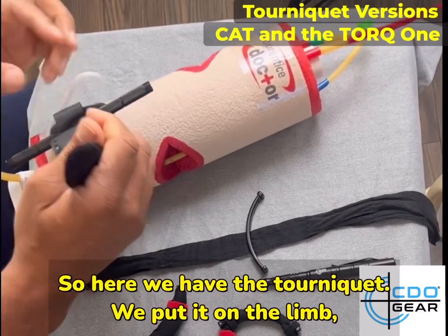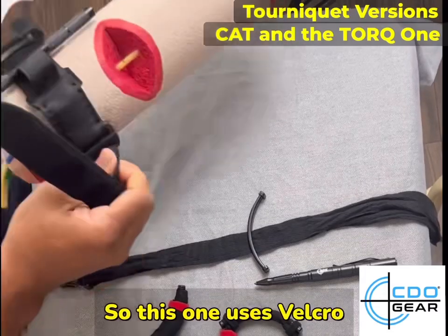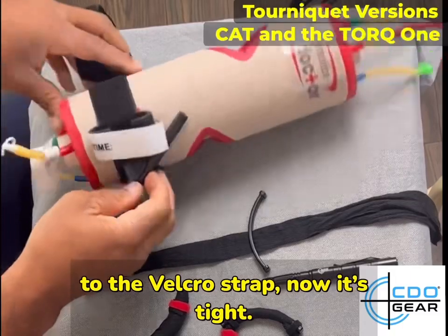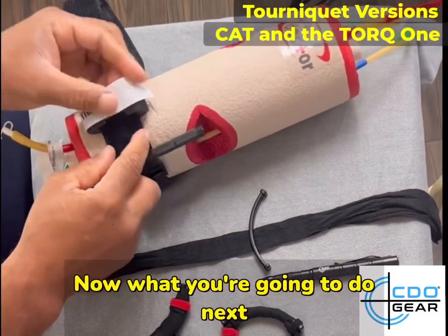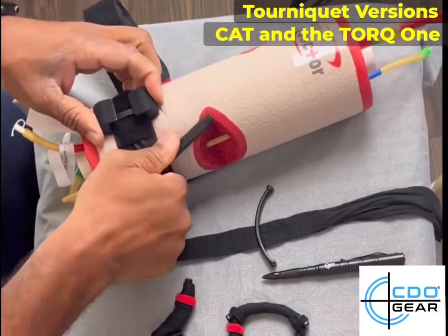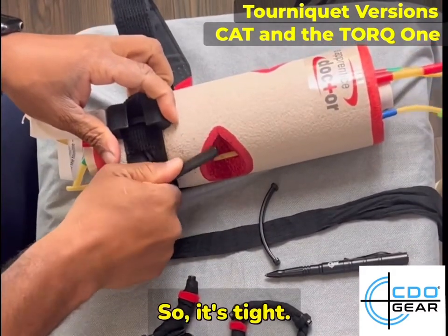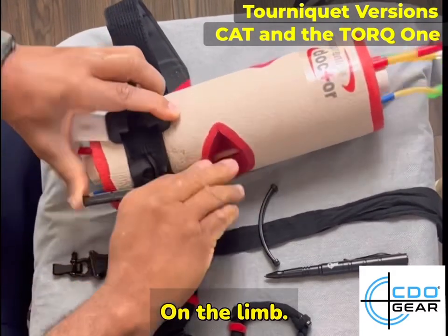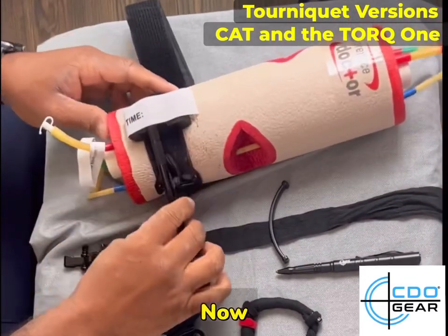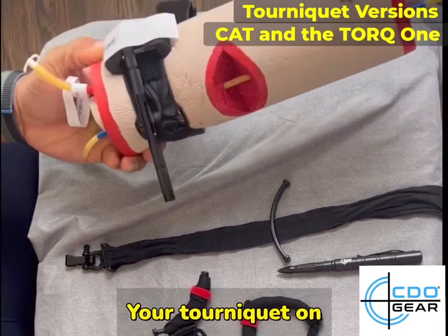So here we have the tourniquet. We put it on the limb and we're going to tighten it down. This one uses Velcro — you tighten it down to the Velcro strap, now it's tight. What you're going to do next is take the windlass and twist. Just keep twisting until it's tight on the limb, and then snap it inside and Velcro. So now this is your tourniquet on.